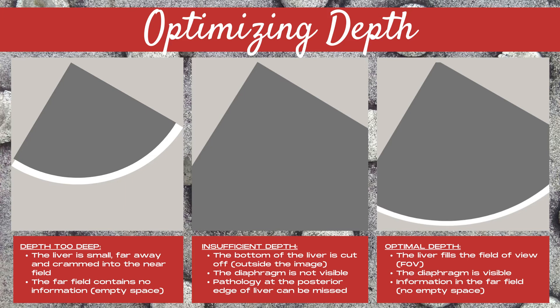The last image to the far right displays the optimal depth. The liver fits into and also fills the field of view. The diaphragm is clearly visible along the posterior margin of the liver, and there's information in the far field — meaning there's no empty or dead space. Because the liver fills up the entire image, this space contains information, or contains the area of interest within it. And that is what we're striving for on an ultrasound image.